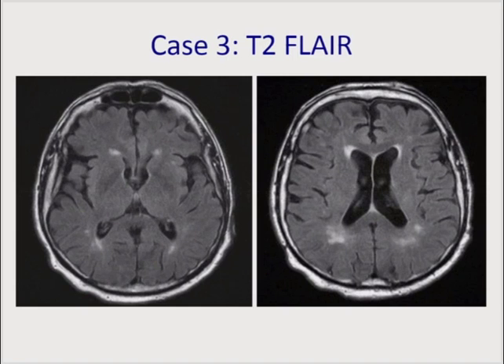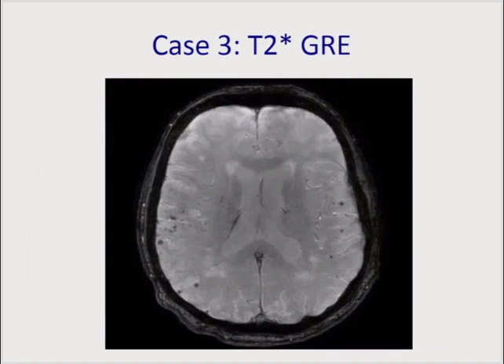And there was no sign of this on exam at all, but actually if you look at his susceptibility weighted imaging, you see yet another finding, which is that he had numerous microbleeds that weren't detected by any other imaging. So this by itself meets criteria for probable cerebral amyloid angiopathy, and so that's certainly a concern, especially since this individual was on Coumadin with increased intracranial hemorrhage risk.